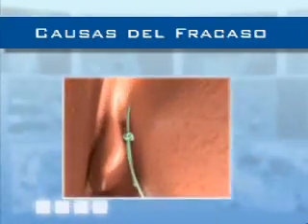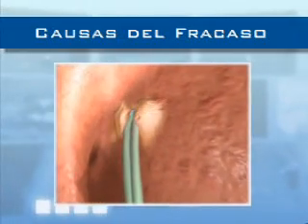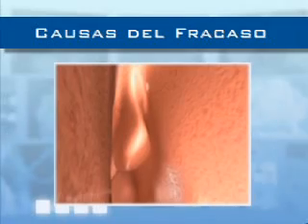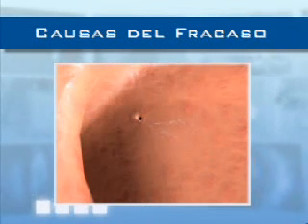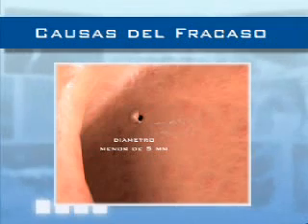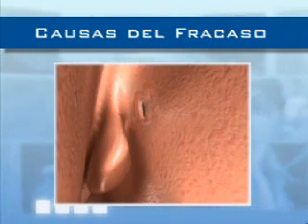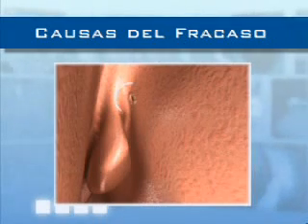The most frequent causes of failure in dacryocystorhinostomy are scarring of the soft tissues surrounding the surgical fistula, synechia of the nasal mucosa, inappropriate size, particularly if the initial opening is less than 5 millimeters, and inadequate location of the osteotomy, which ideally should be at the level of the common canaliculus.